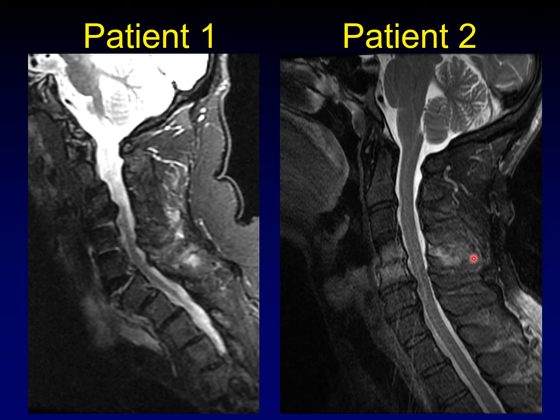This infection looks a lot alike — abnormal signal in front, abnormal signal in the interspinous region — but here the effect on the disc is very different. Here we have disc collapse, and of course the enhanced images that I withheld.